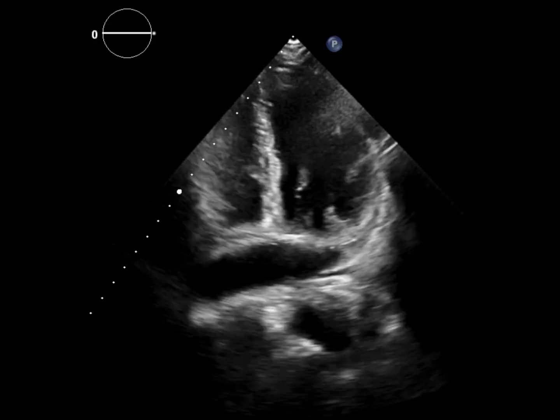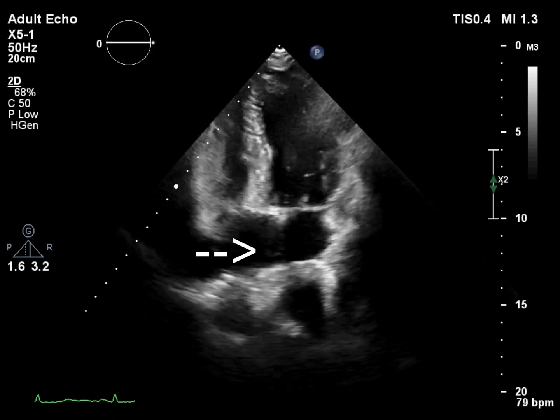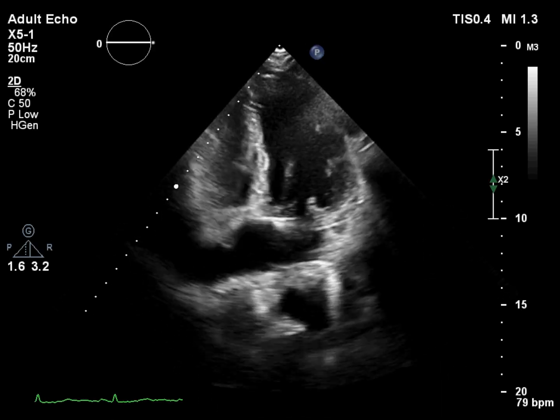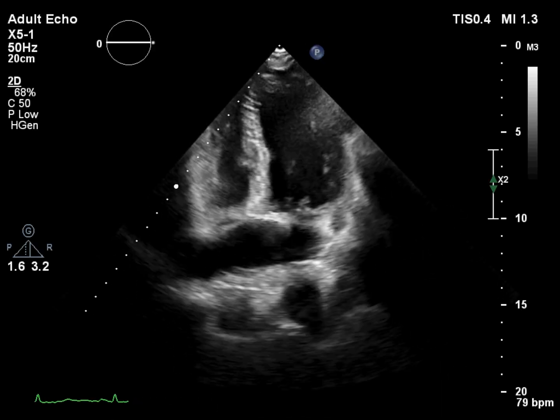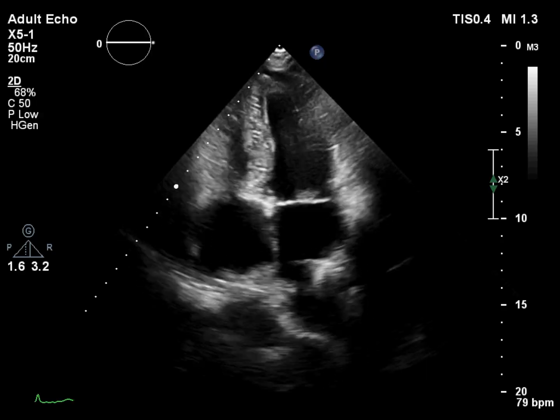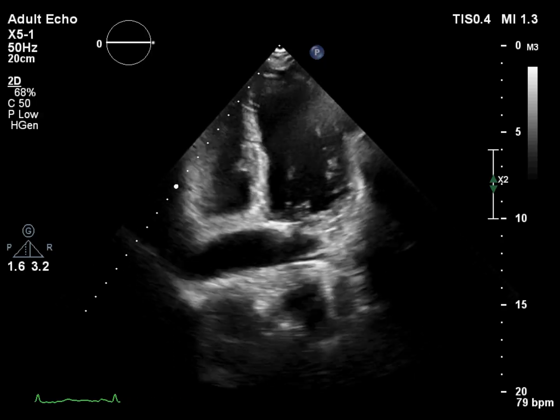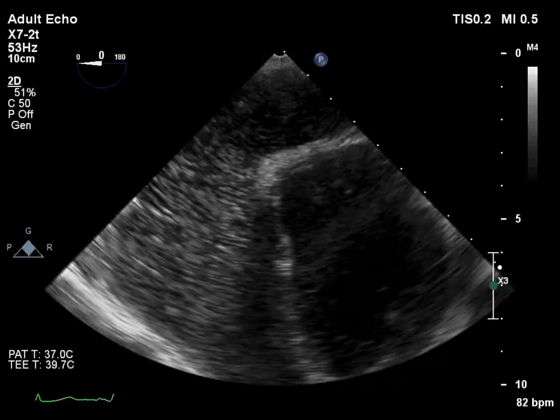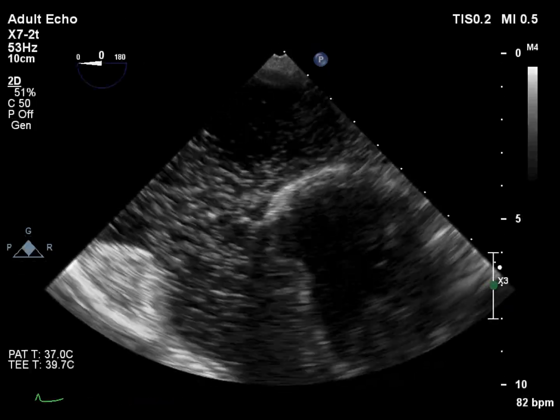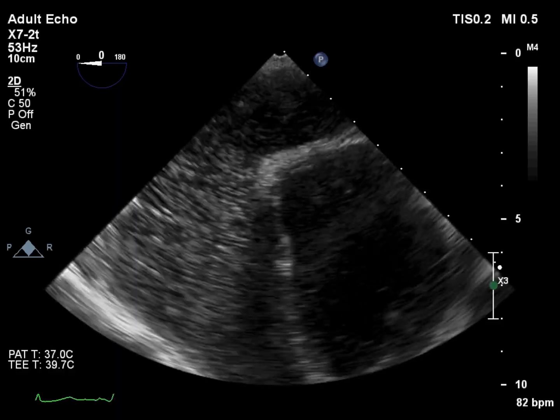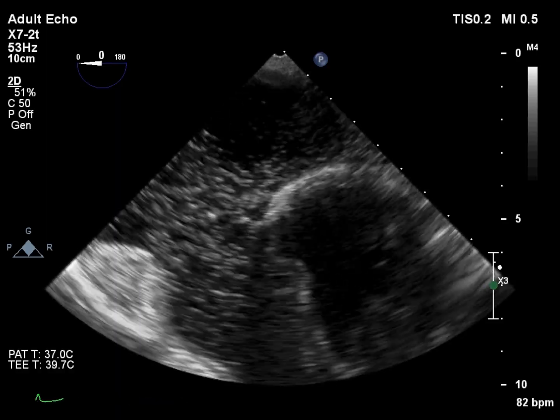In this view, a large coronary sinus is visible, but the atrial septum appears intact. Now let's focus on the transesophageal echocardiographic views.